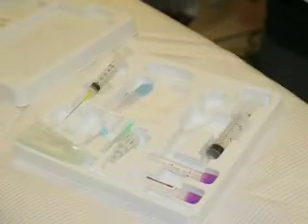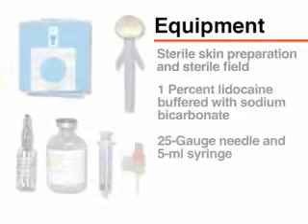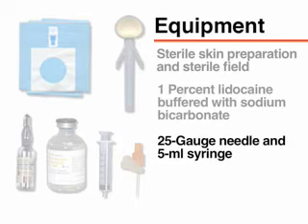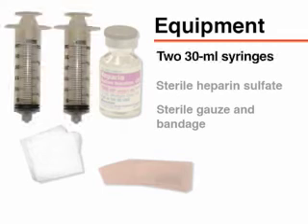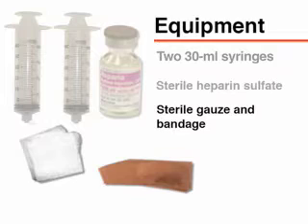Gather the necessary equipment prior to performing the procedure. You will require equipment for sterile skin preparation and a sterile field, 1% lidocaine buffered with sterile sodium bicarbonate, a 25-gauge needle and 5 milliliter syringe, a bone marrow aspiration needle, a bone marrow biopsy needle, 2 30 milliliter syringes, sterile heparin sulfate, sterile gauze, and bandage.